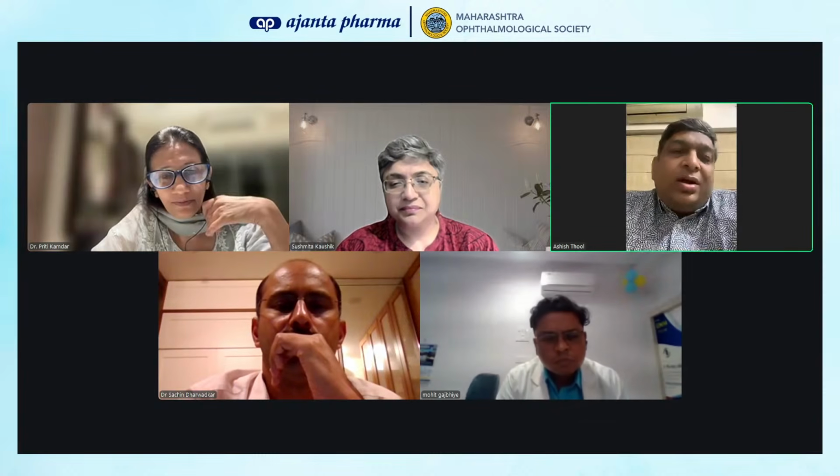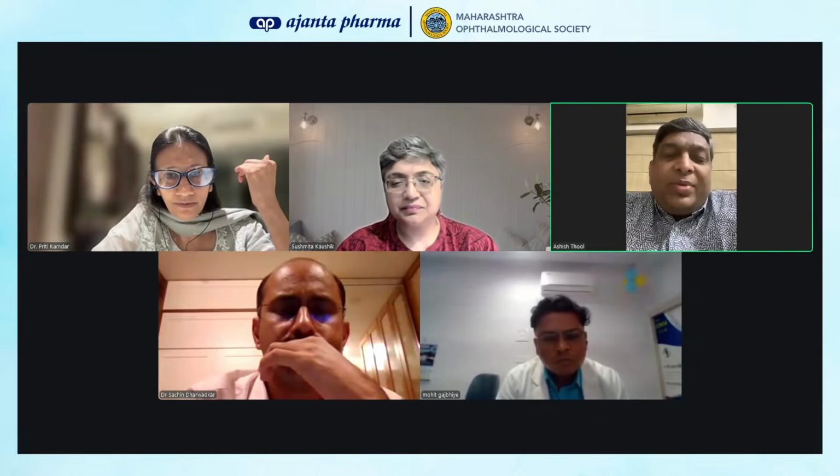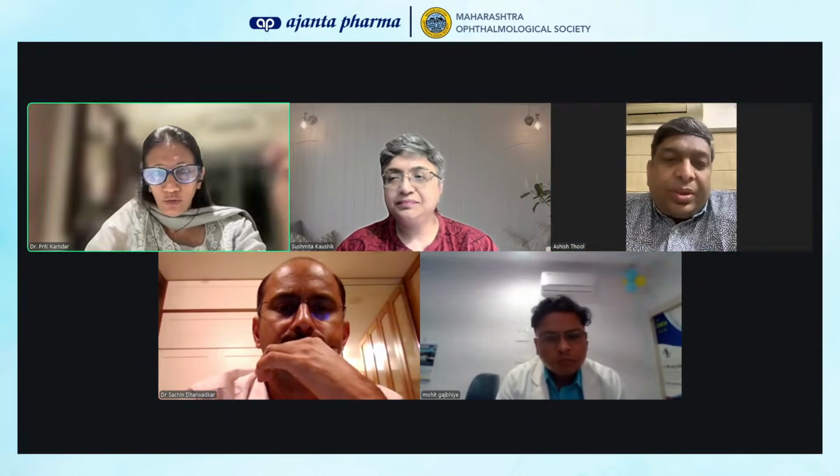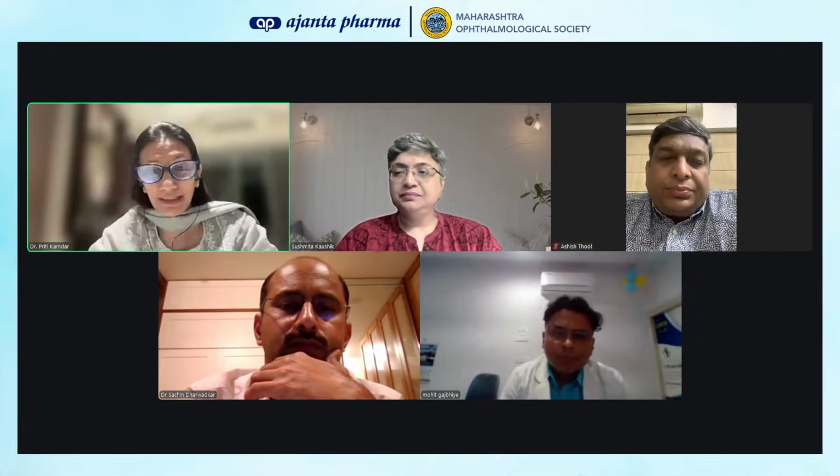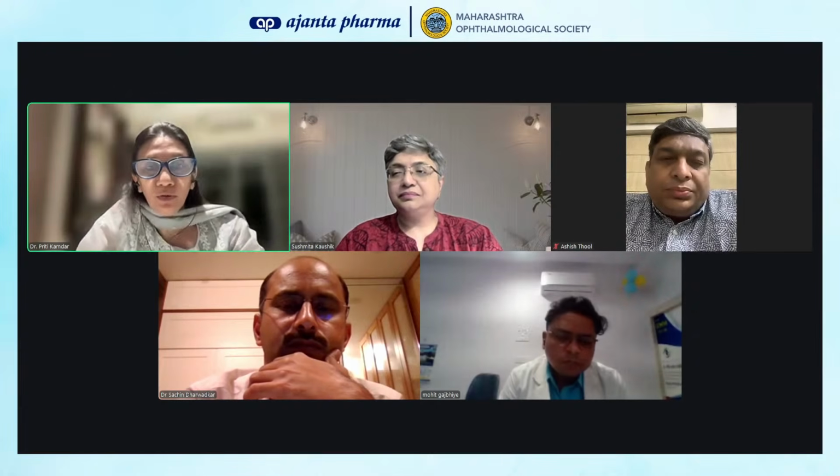Just that drop that she mentioned, making sure that the ocular surface is good. Similarly, you can have other media opacities causing changes in the RNFL thickness. So going absolute by the numbers only won't be a good advice. So if I'm safe in giving a message to the audience, don't go into absolute numbers. Yeah. Repeat. Like perimetry, there is noise even in OCT, maybe to a lesser extent, but it looks very fancy. So don't go by numbers. Look at the overall thing.